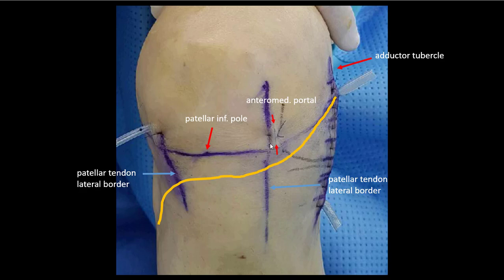Above this line I make the portal — this is the entry medial portal, and this is the inferolateral portal. This is usually a safe region to protect this nerve. Thank you.